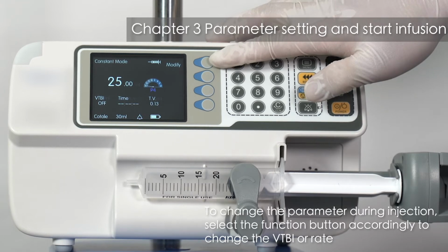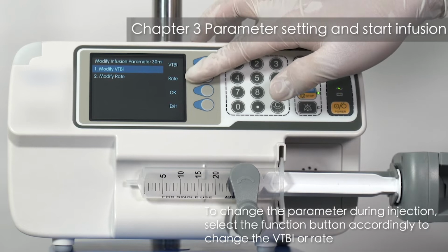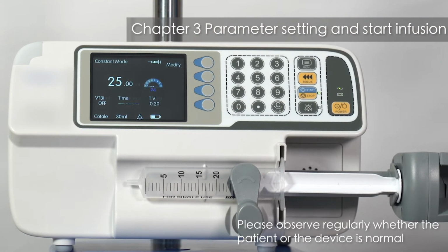To change the parameter during injection, select the function button accordingly to change the VT-BI or rate. Please observe regularly whether the patient or the device is normal.